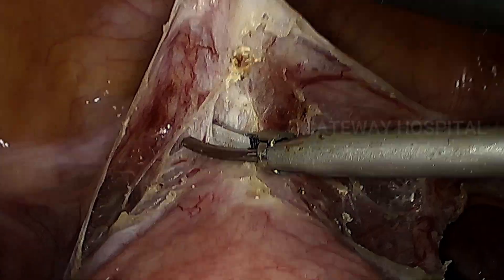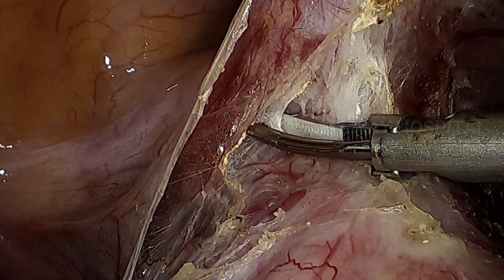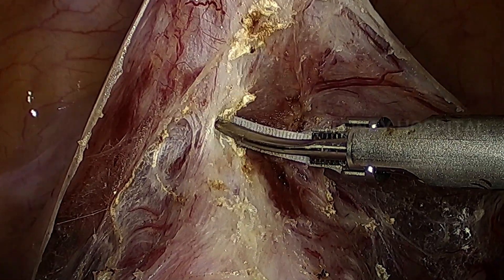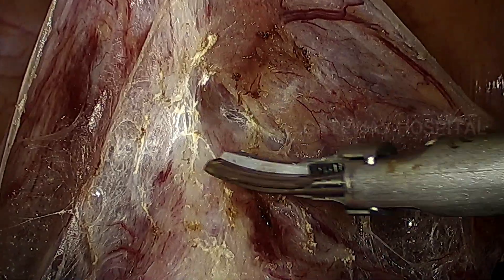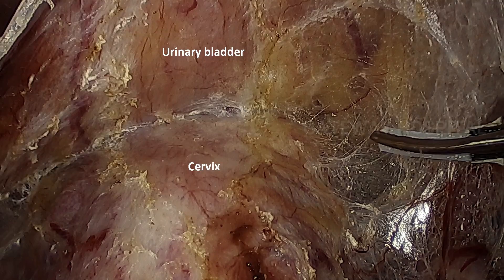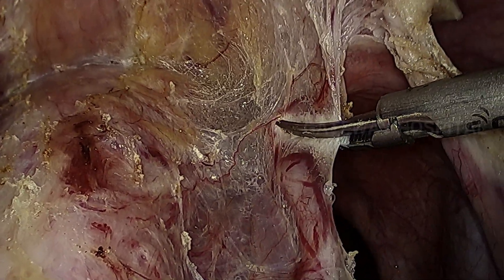The harmonic scalpel is very useful for this part of the dissection. For dividing the pedicle, we can use a bipolar, but the harmonic scalpel has an advantage. Continue until you see the shining smooth cervix surface. You have to create a plane — you can see the cervix posteriorly and the urinary bladder anteriorly, with a nice plane coming in between, and you can also appreciate the course of the right uterine vessel.